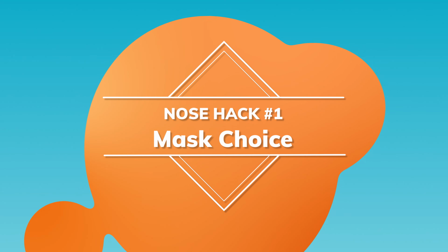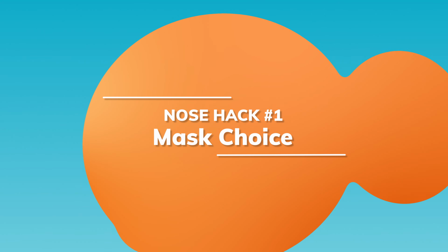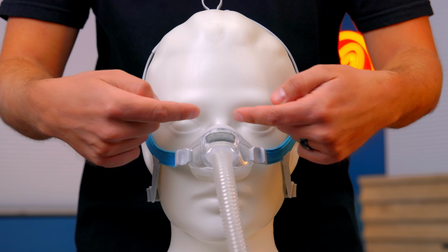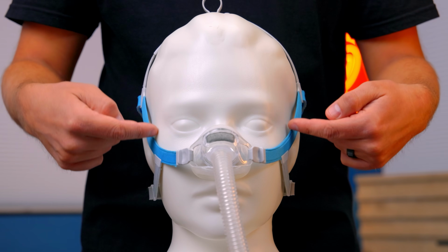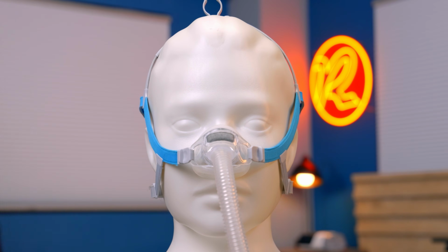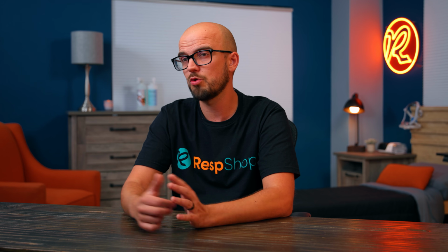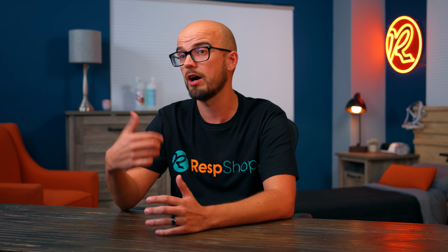Hack 1. It might sound obvious, but you should try and choose a mask that avoids any contact with the bridge of your nose at all, like a nasal mask, a pillow mask, or a hybrid style mask if you're a mouth breather. There are far more options like this on the market than there used to be, and this solves almost all problems associated with having a high bridge.